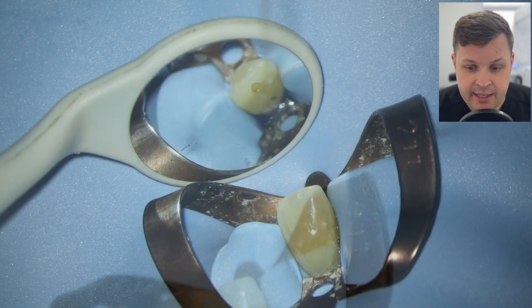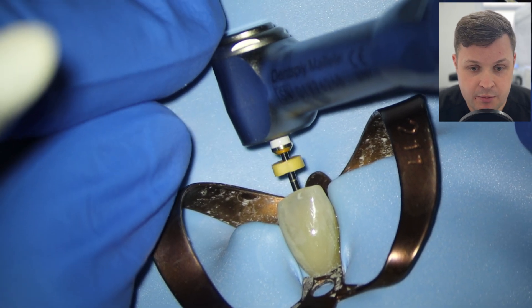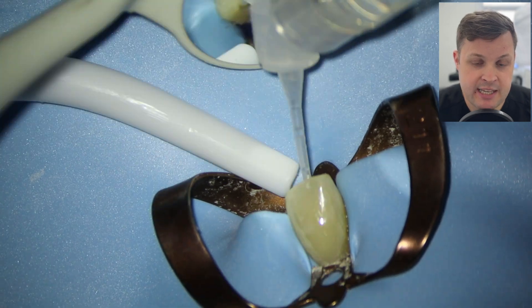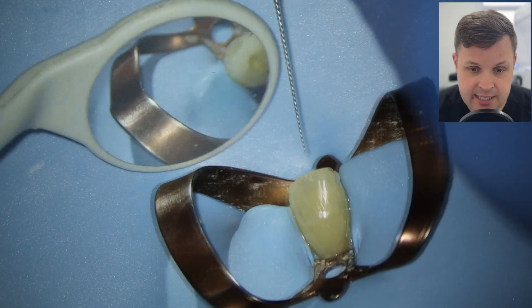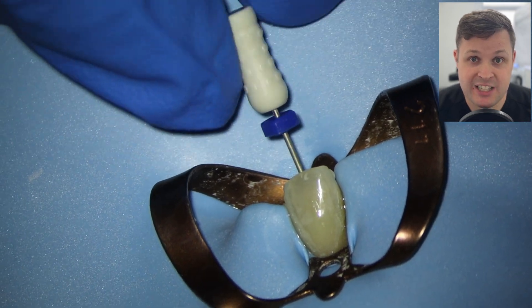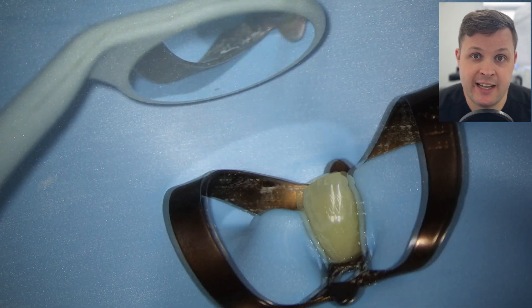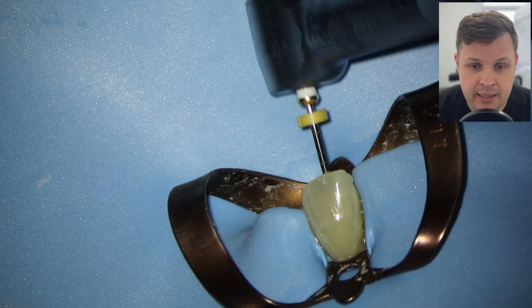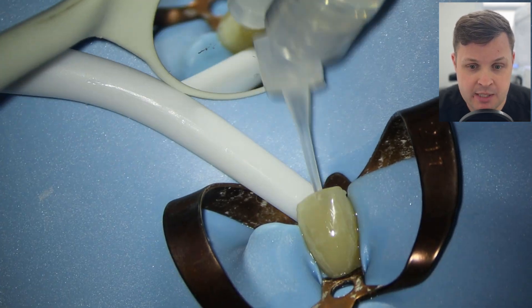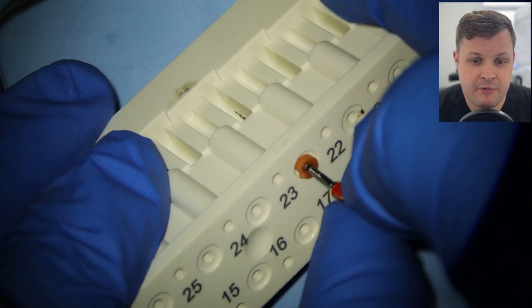We're ready to shape with our Hyflex glide path file to the zero reading at 23 millimeters. If it isn't reaching down to zero quickly and easily, don't push it — just pull it out and recapitulate. In this case it reaches the length really nicely. Lots of irrigation is important, and recapitulation means getting your size 15 hand file to the zero reading making sure the canal space is patent and open. Then we do a bit more shaping with the size 1503.